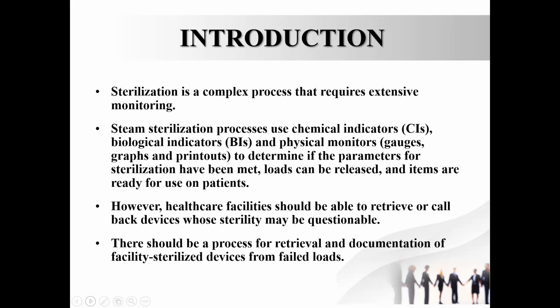The gauges, the graphs, the printouts that we use are called physical monitors. And they check if the parameters for sterilization have been met. That means correct time, correct temperature, correct quality of steam. And then we can release the load based on these.